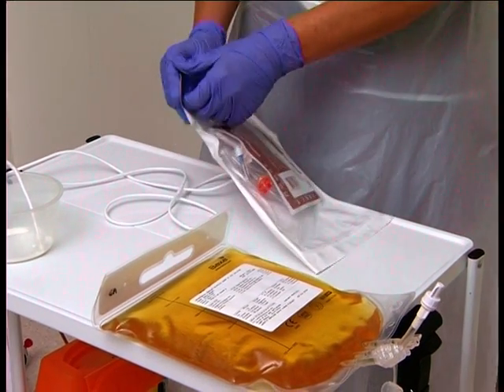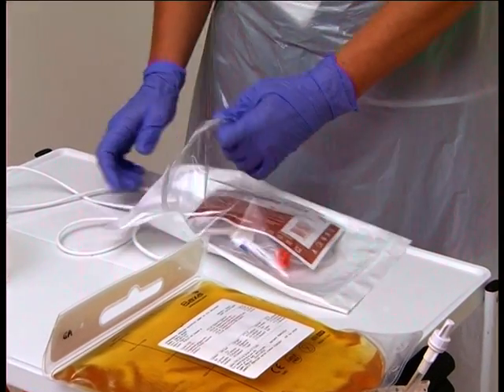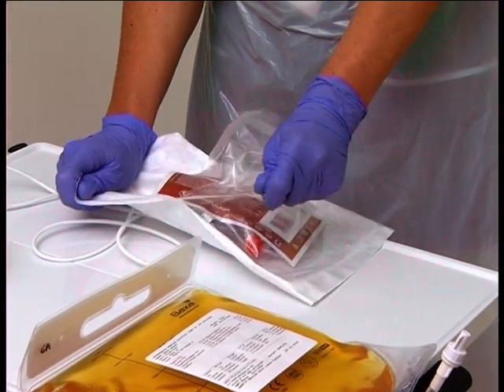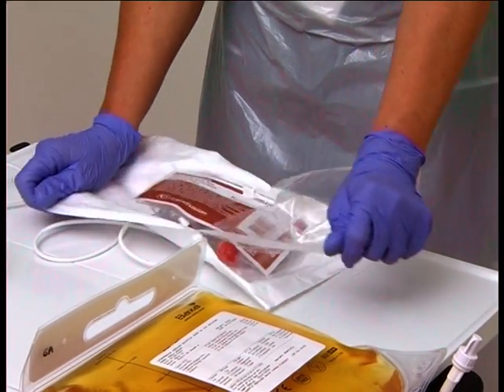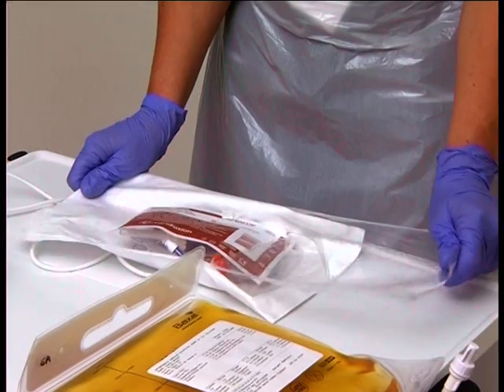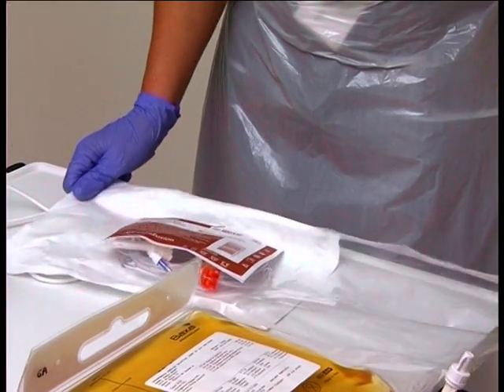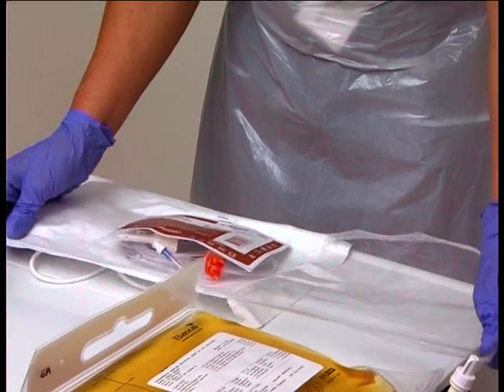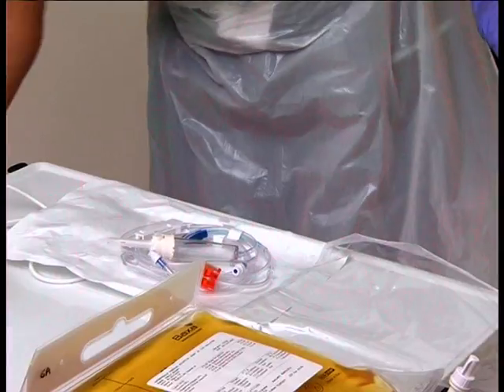Carefully peel open the packaging containing the giving set with the filter, taking care not to let the giving set fall off the packaging and not to touch the central parts of the packaging or the exposed smart sites, which in this instance are the key parts. Throw away the paper label.